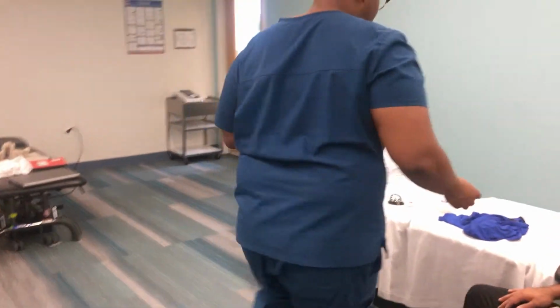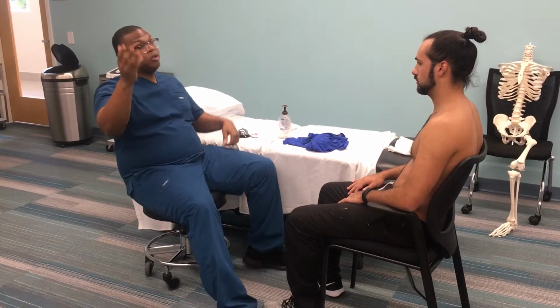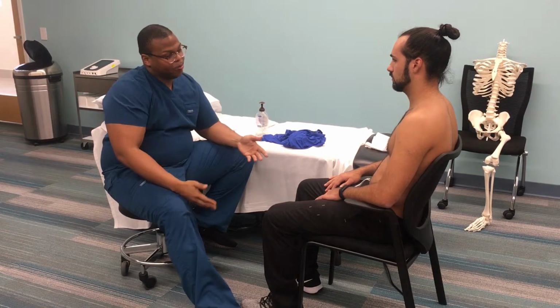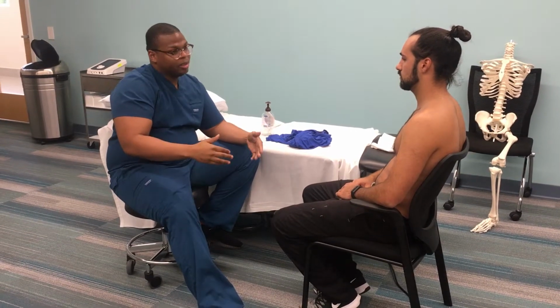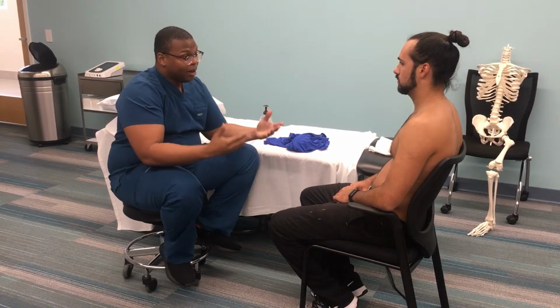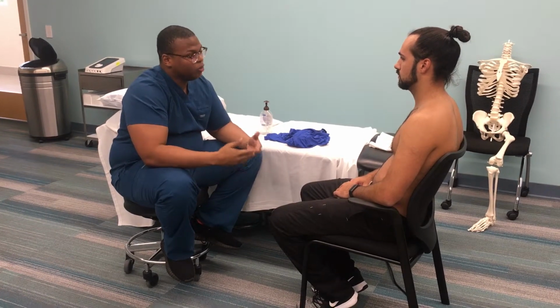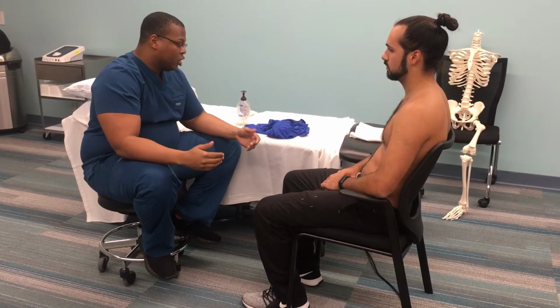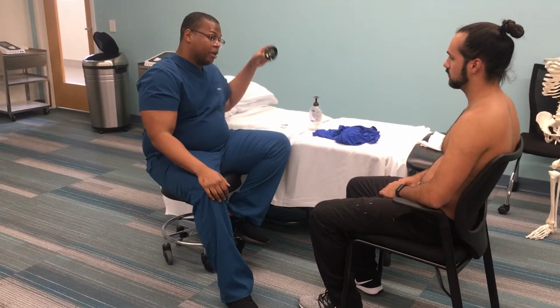So now we're going to talk about the parameters of the treatment. I've already got the hot pack. The water it's taken out of is at 163 degrees, which falls in the range of what the hot pack should be. I'm going to place the hot pack within 8 layers, and that's for your own protection to reduce the intensity of the heat, so you don't get burned. The normal sensation you should feel is heat and warmth at first, and then it might get a little bit warmer. You're gonna feel relaxed. If at any point you feel that it's a little too warm, a little too hot, you can use this call bell and let me know.